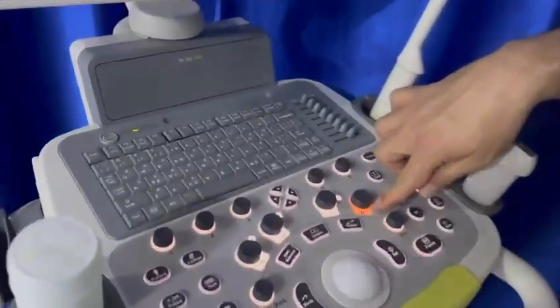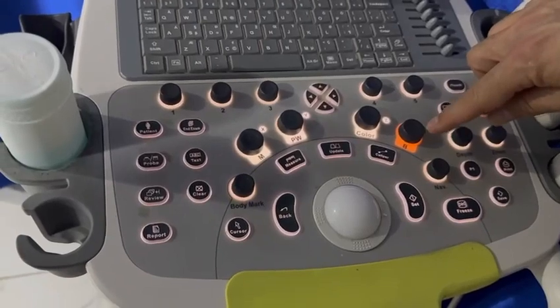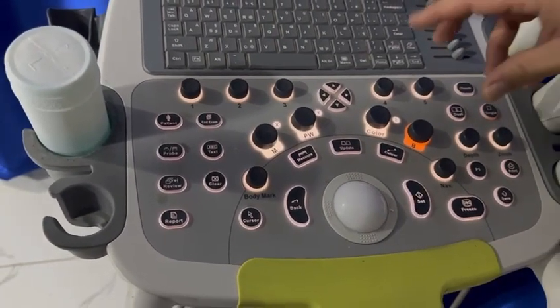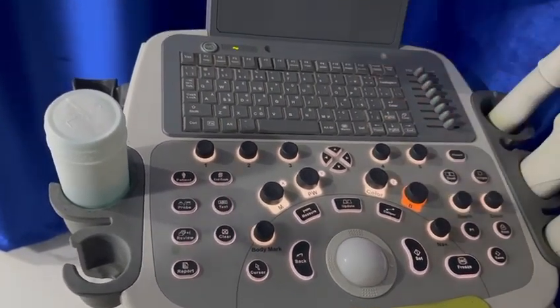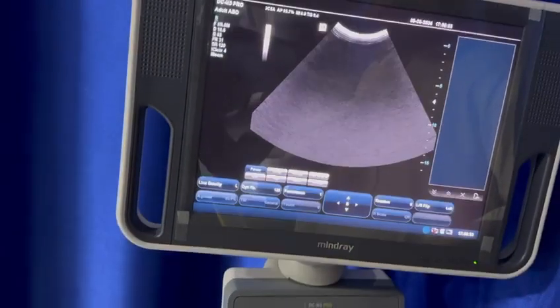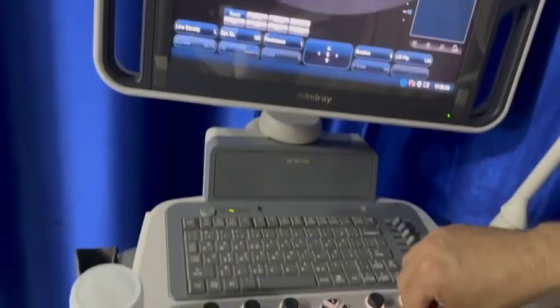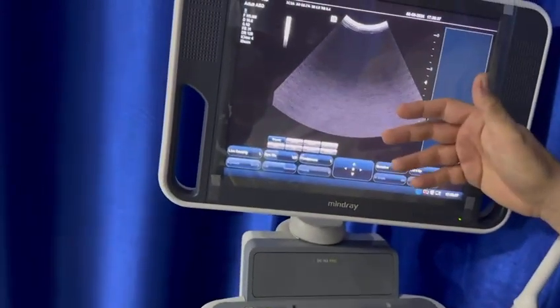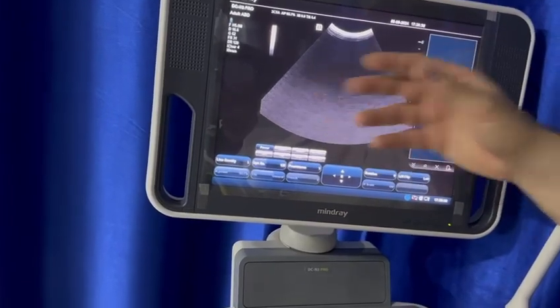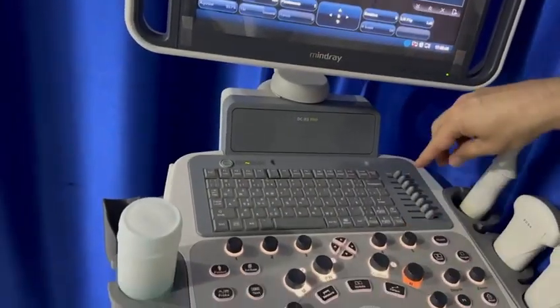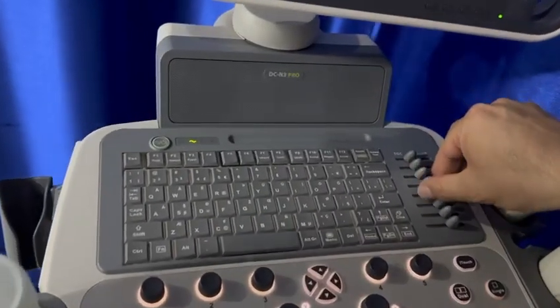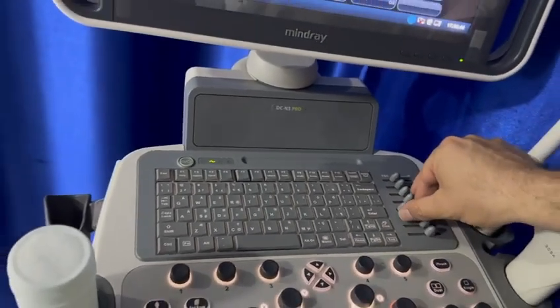Hi everybody, let's talk about the TGC, 2D gain, overall gain, or receiver gain — what is the difference between them? As you can see here, the B-mode or brightness mode has a button for the 2D gain or overall gain or brightness. If I increase or decrease it, it will affect equally the entire picture from top to bottom, left to right. If you change only the TGC — time gain compensation — it will work only in a specific area.